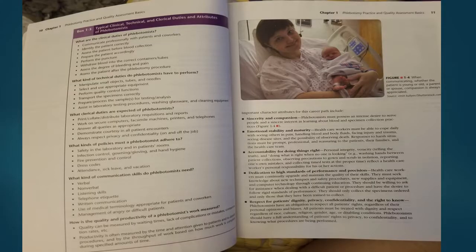Box 1-3 shows typical clinical, technical, and clerical duties and attributes of the phlebotomist. What are the clinical duties of the phlebotomist? Communicate professionally with patients and coworkers, identify the patient correctly, assess the patient before blood collection, prepare the patients accordingly, perform the puncture, withdraw blood into the correct containers or tubes, assess the degree of bleeding and pain, assess the patient after phlebotomy procedures.